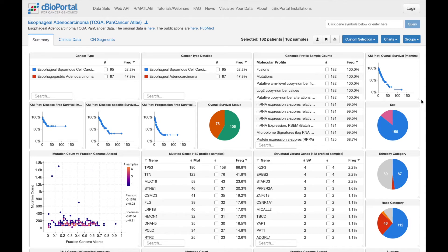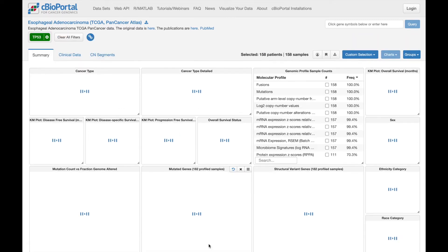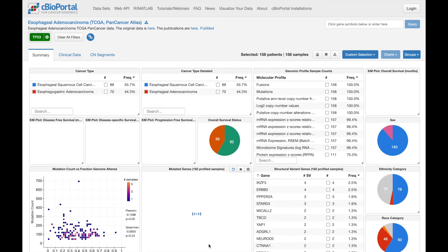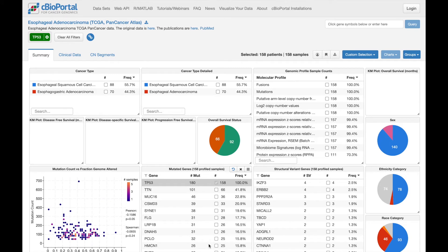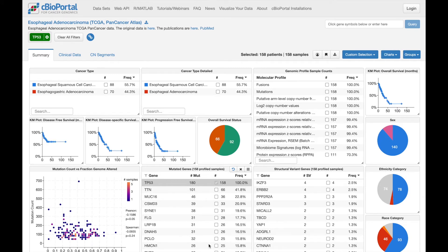However, there's a lot more you can do. All of these tables and charts are interactive, so you can use them to filter the cohort down to particular subsets. For example, I can select samples with p53 mutations by clicking this box and then the select samples button below. And now we see all the charts updating to show only the features of those 158 samples with a p53 mutation.